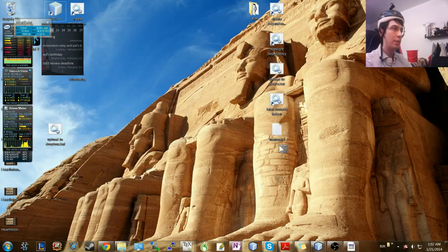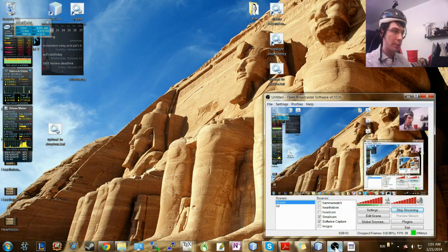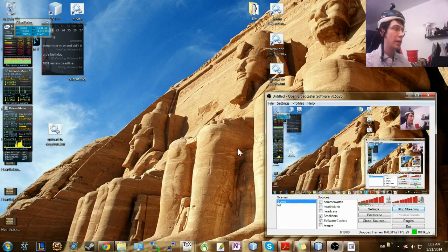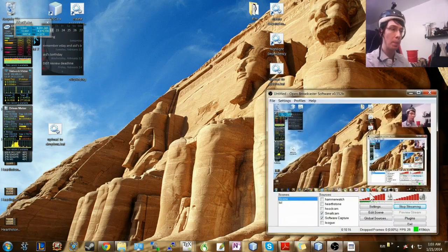And I guess that's my demo. I'll conclude by saying that you can do a lot of fairly high precision stuff. In particular, something that's quite surprising is you can actually play games, even competitive online games, with this, provided you're willing to put in a little bit of time to figure out a control scheme that works for you. Usually you need more inputs than a couple of buttons with your feet, so you might have to do a little bit with a keyboard. But if you can choose a couple buttons so your hand doesn't have to move, you can do that, pretty low stress, and not using a mouse, you can substitute the mouse for this head movement. So I find it works pretty well in slow-paced games, and even in a couple fast-paced games. So at some point I'll make a video to show that that's actually feasible.